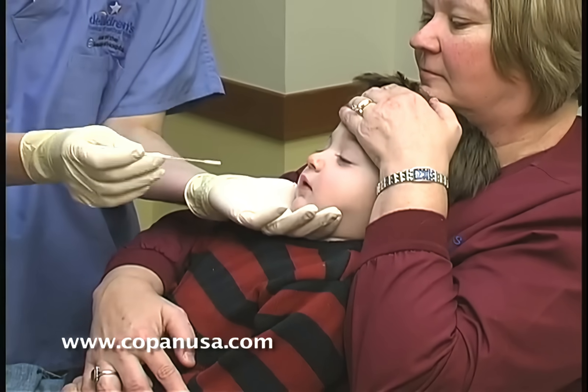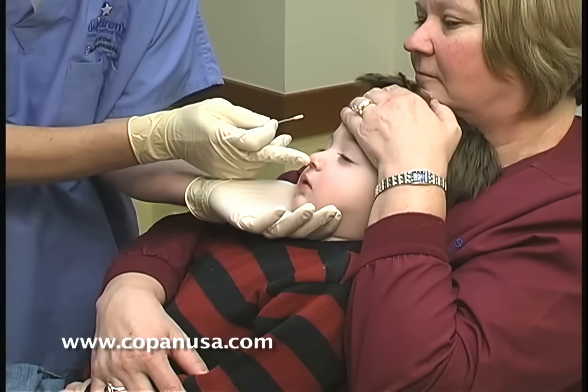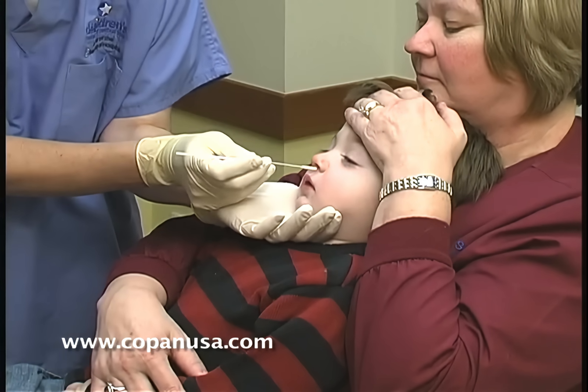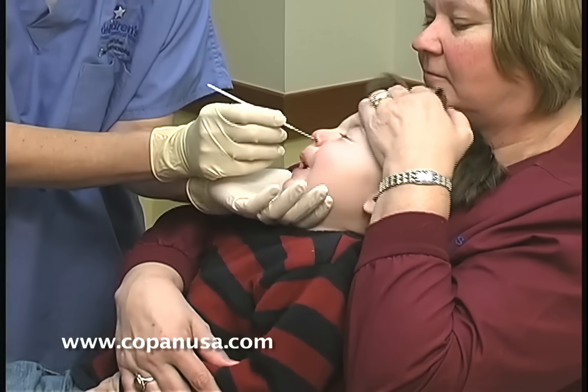You can see the depth of the nasal swab. You can kind of push the nose up to help get the swab in. I usually don't do that because what I do is I go in just a little and then turn.